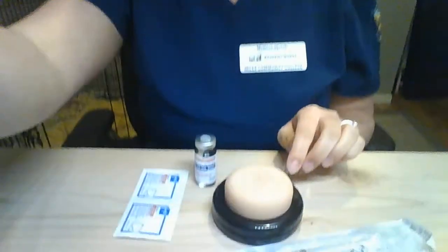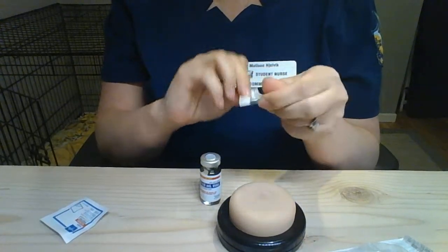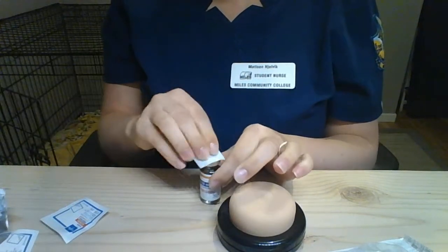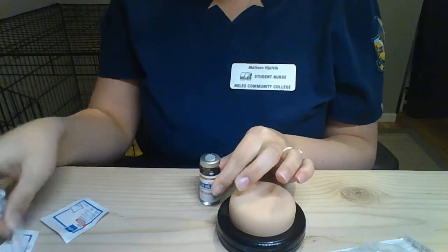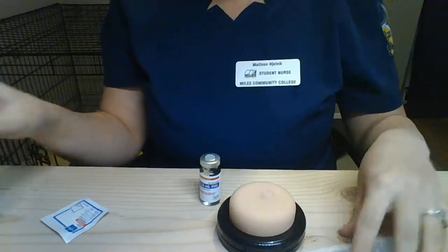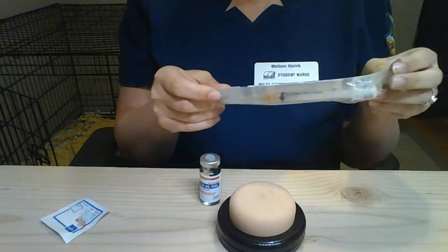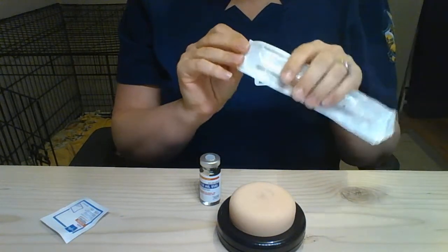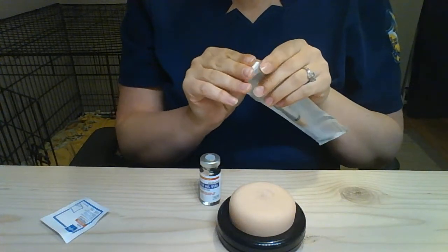Remove the cap and take an alcohol swab and clean the top. Dispose of that. I need to select the correct size of syringe and remove it from the container.